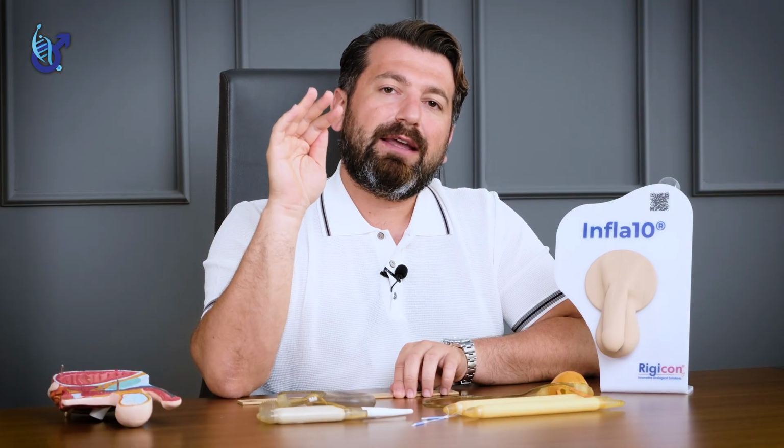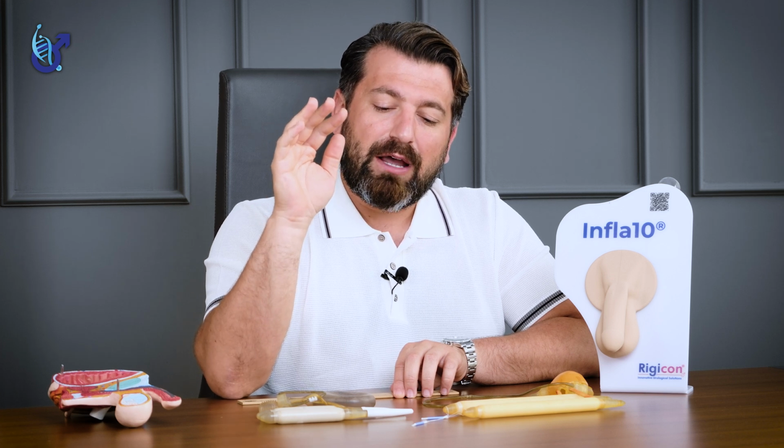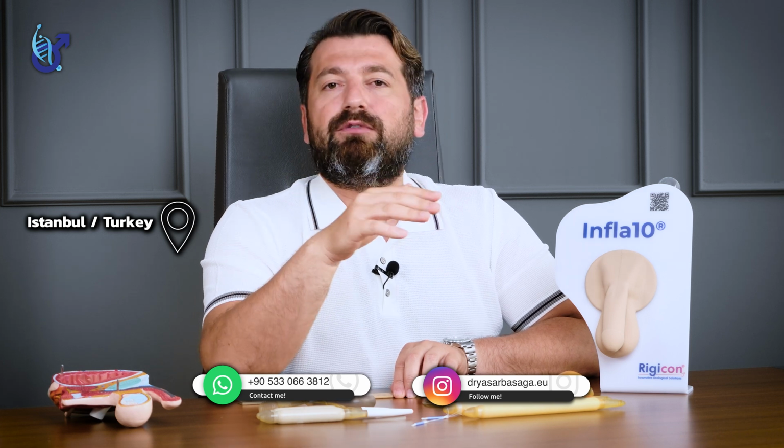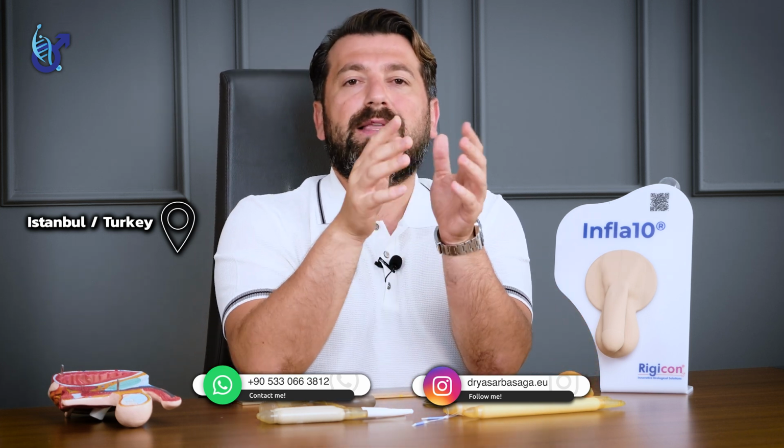If you think of getting penile implant surgery, you have to choose the right clinic, because the first surgery in penile prosthesis is very important to have fewer complications and higher satisfaction rates. When you see these implants, this is a good surgery. For example, when you see from outside, the tips of the implant are located under the glans penis and everything looks great, but the patient cannot penetrate the vagina.